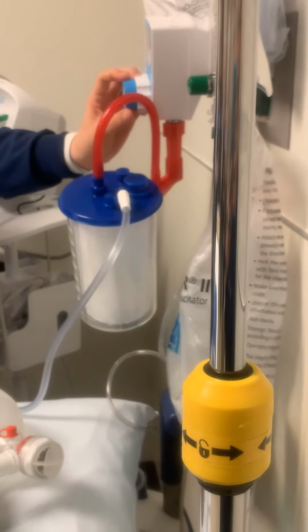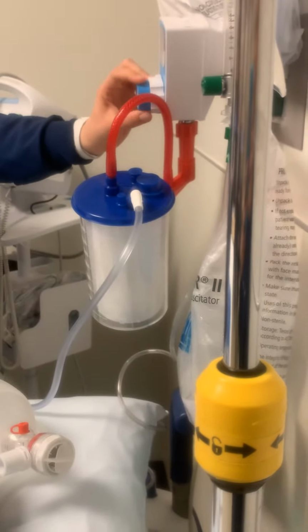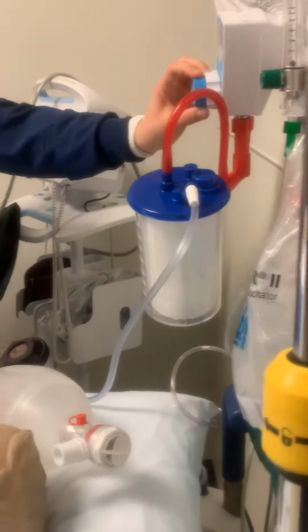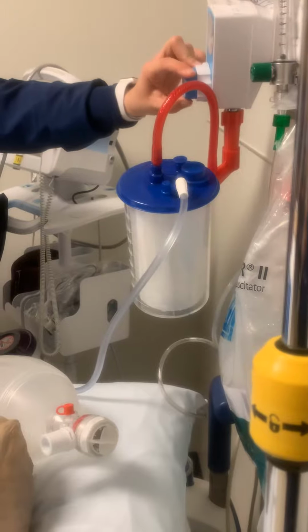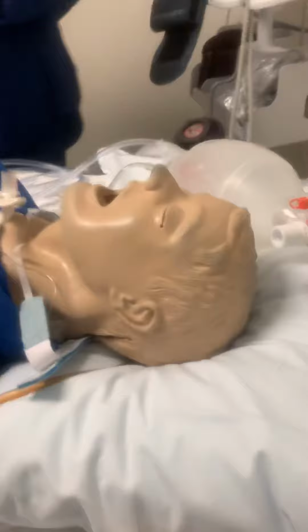Okay, so no more than 150. On that little sheet you sent me, I thought it said like 120 was optimal, is that right? 150. Okay. So if you've watched clinical skills, it's 150 or less. But you don't want to go too low, because then you're not going to be able to suction. I'd say about 150 is where you want to be.